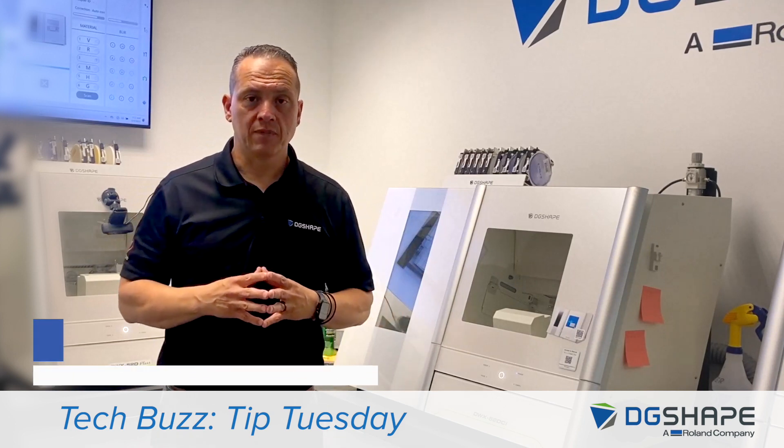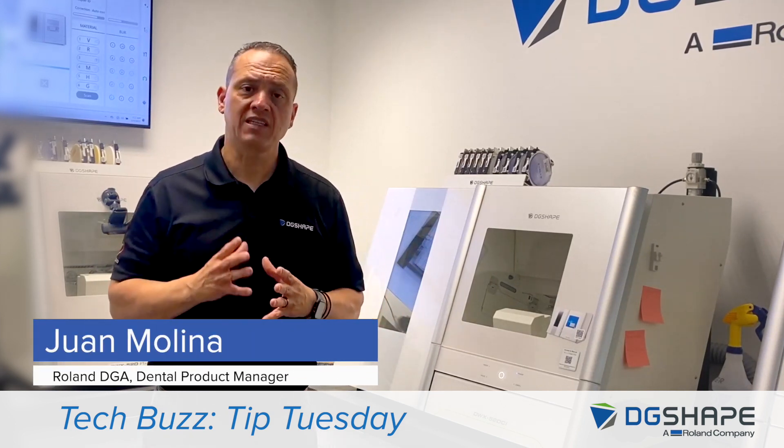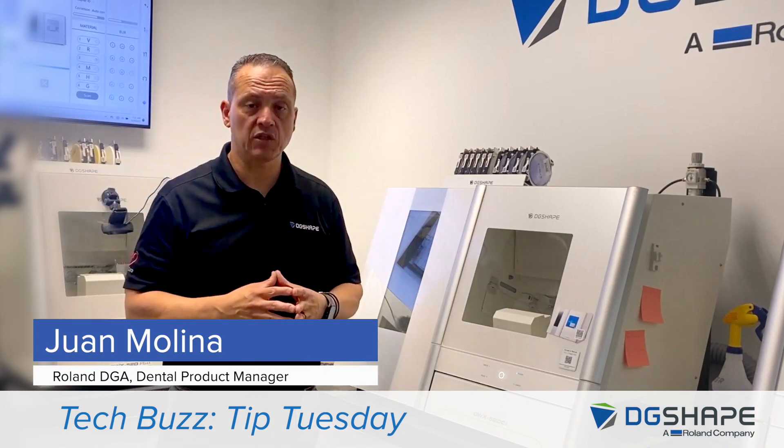Hi, I'm Juan Molina, DG Shape Dental Product Manager. A while back, we performed a disc changer adjustment from vPanel. Today, we want to run through a test with the DWX52 DCI.